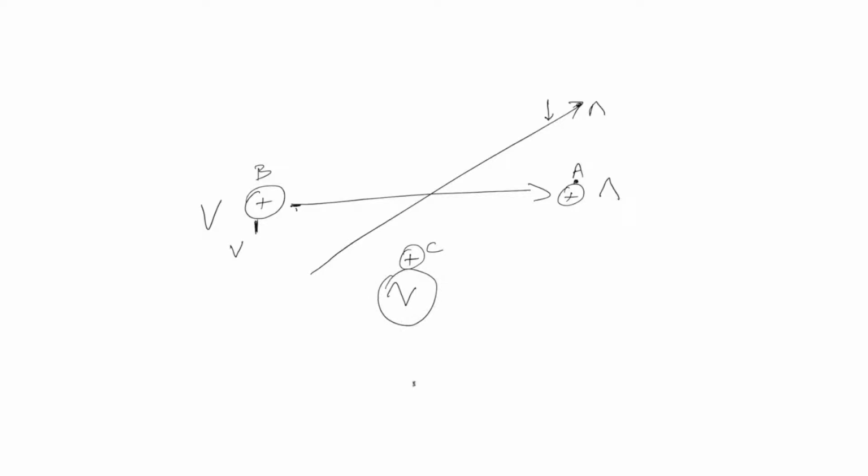So in other words, if you have a perpendicular electrode and the current's going like so, or like so, or like so, all three would essentially generate an impulse that looks like that. So notice how we're able to define the direction of the electric flow as well as the intensity of the electricity flowing by looking at the wave that's being produced.